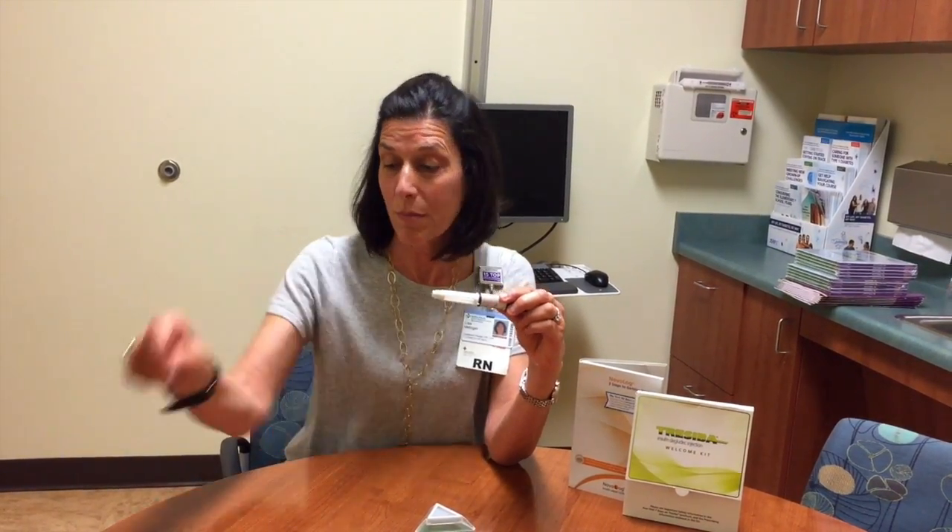You have the inner pen needle. I want you to take the inner pen needle off and immediately discard this so that you don't accidentally try to recap the needle and prick yourself, because that wouldn't be fun.